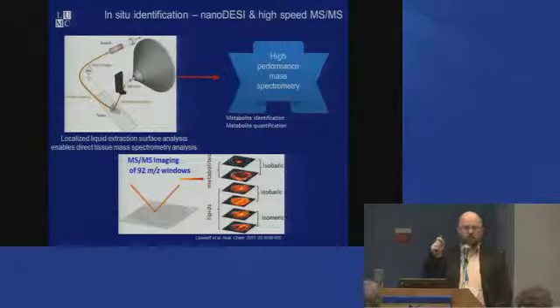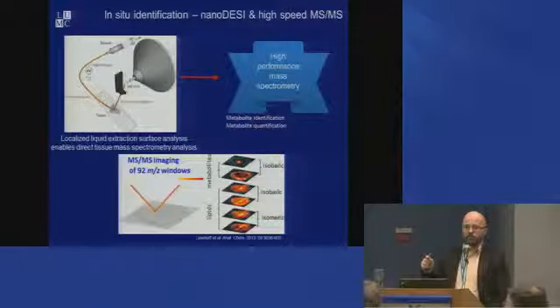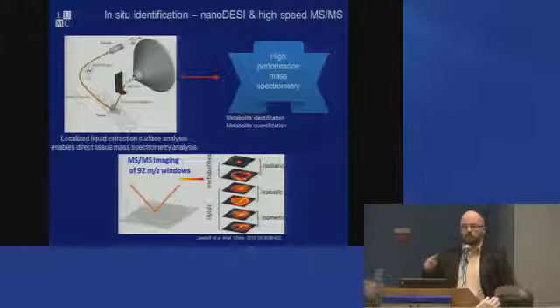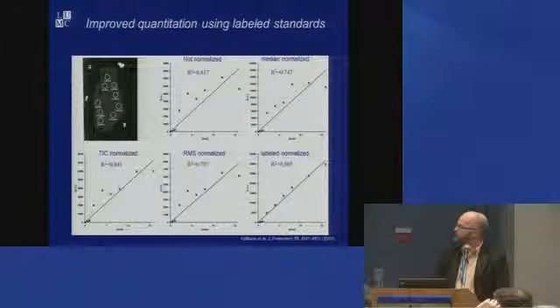By having a very small spot size and moving the tissue very slowly, within a spot of 150 microns, they could get their MS signals, so you could get the imaging mass spectrometry data, but they could also cycle through 92 different m/z isolation windows and perform MSMS. So then you can have real in situ confirmation of all of your identities, and that way you can reduce the number of pathways that you map your data to, because you're much more confident of what the identities of your metabolites are. So we're currently setting this up in Italy at the moment.